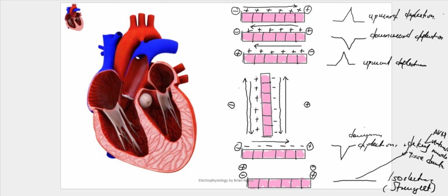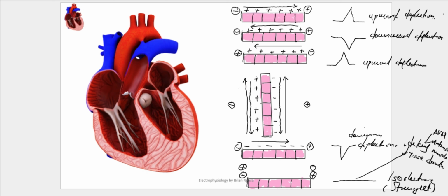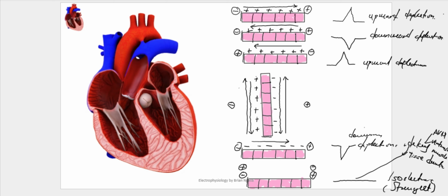As it moves downwards, it might seem as though it is moving towards the center. While it's moving toward the center, in respect to its charge, you will say that it is moving towards the positive. So this gives you a curve like this.